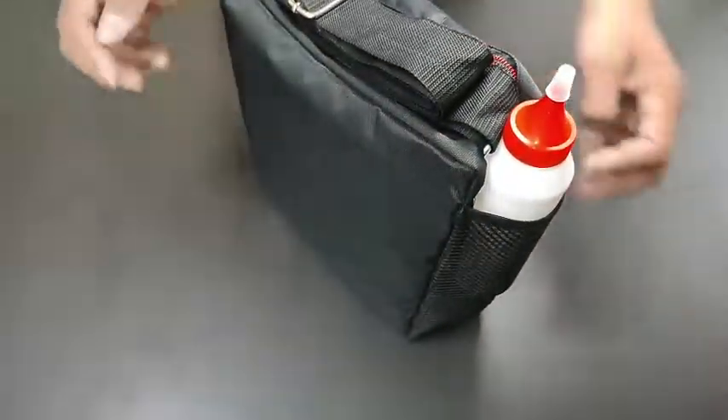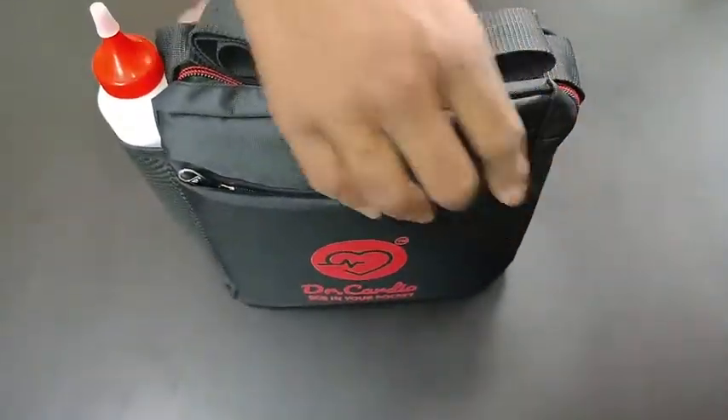Welcome to the virtual demonstration of the Dr.Cardio 12 channel ECG machine.